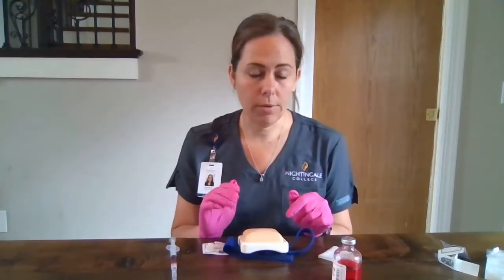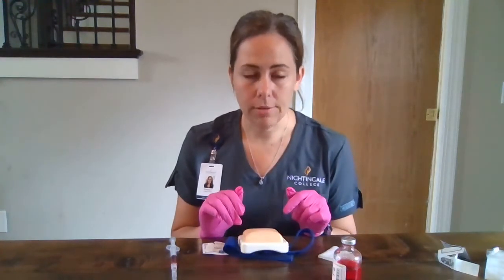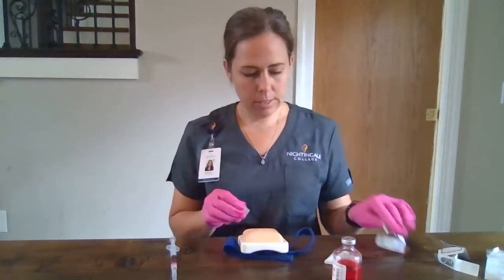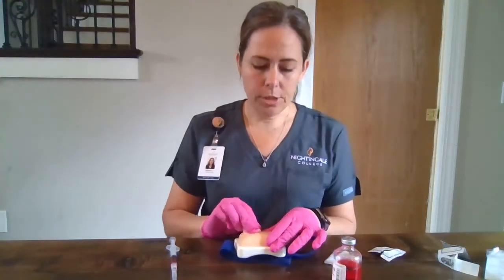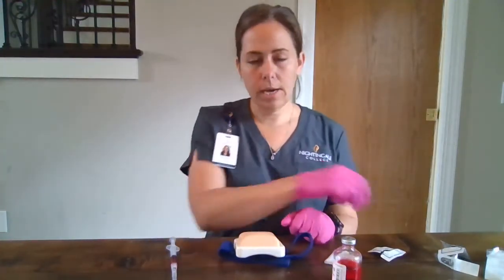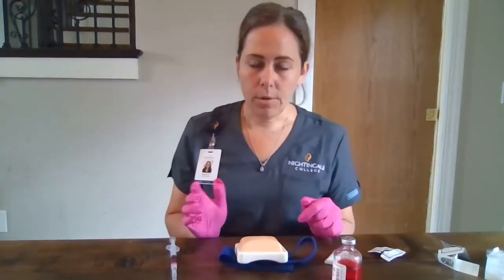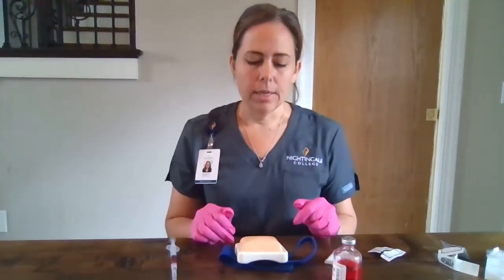So we're going to inspect our site for muscle size and integrity. We're going to make sure that there's no bruising, skin discoloration. We're going to palpate for any edema, tenderness, masses, and make sure that he hasn't had an injection in that site recently. We will cleanse our site with our alcohol prep, circular motion inside to outside, about 5 centimeters. We'll let that air dry without blowing or fanning it.